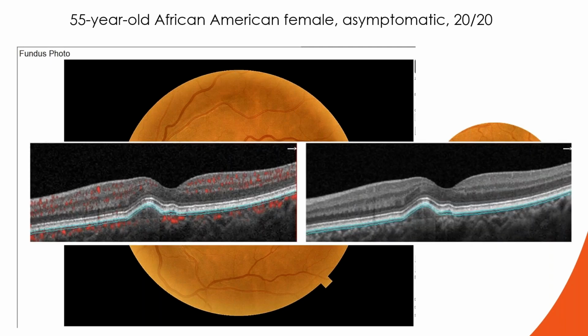And these are her OCT B scans. They really did not indicate too much, but again, hopefully you're getting good at this now. Why is there increased pixelation here underneath this little PED? PEDs should not have increased reflectivity. There shouldn't be any area of increased vascularity. Just like this one is clean, this one should be clean. You shouldn't be seeing this area of increased pixelation here.